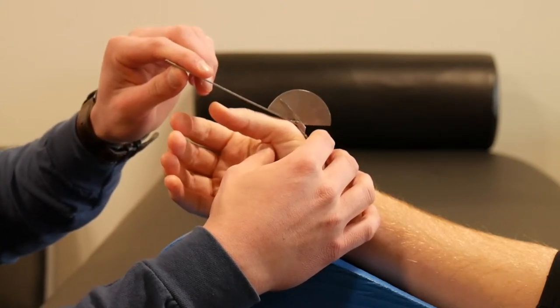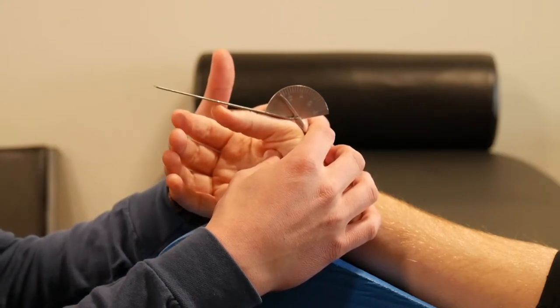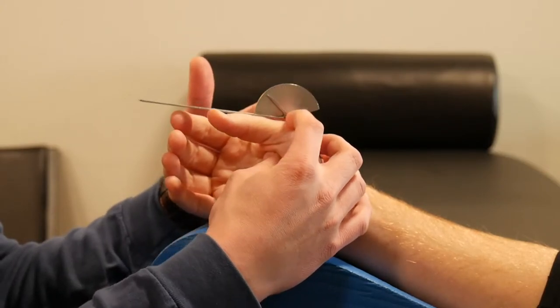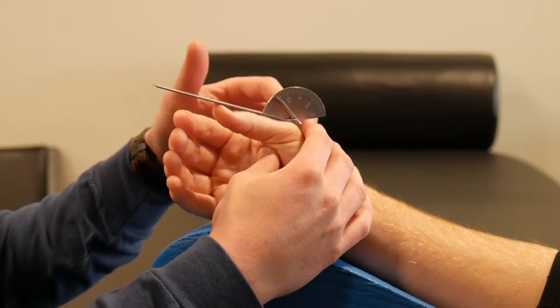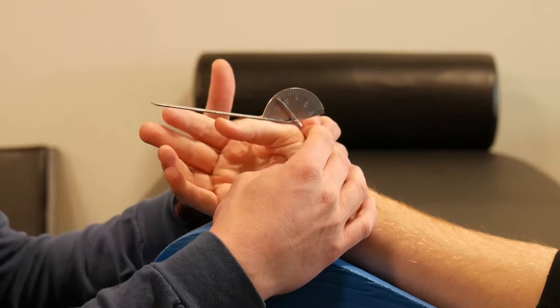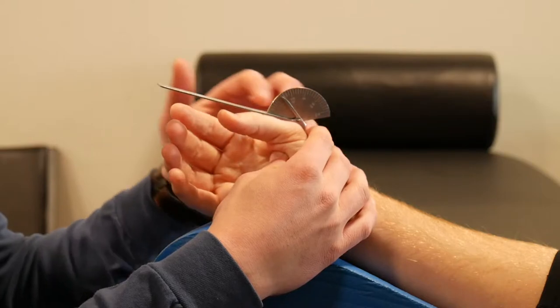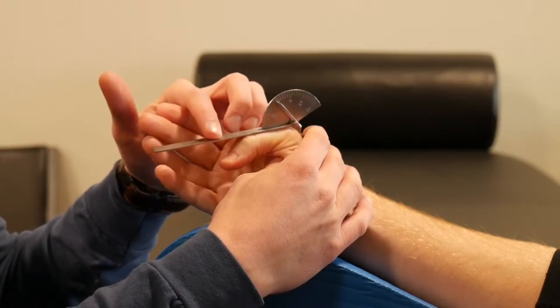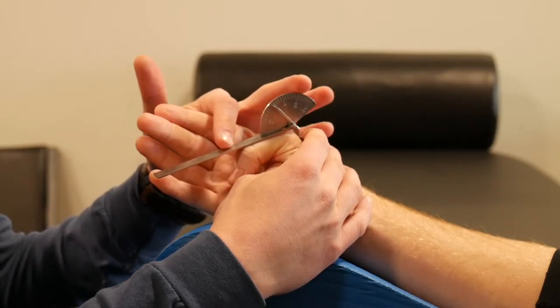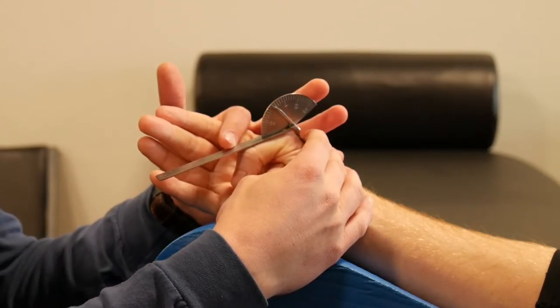We're going to lay the goniometer on the dorsal side of the digit and the hand. The stationary aspect of the goniometer is positioned along the dorsal surface of the first metacarpal, the axis of motion lies directly over the MCP joint of the thumb, and the moving arm lies on the dorsal aspect of the thumb. While stabilizing the proximal portion on the first metacarpal, I ask them to move into MP flexion — I might tell the patient to pull their thumb across their hand — and then follow their motion with the goniometer. He's at 65 degrees of MP joint flexion.